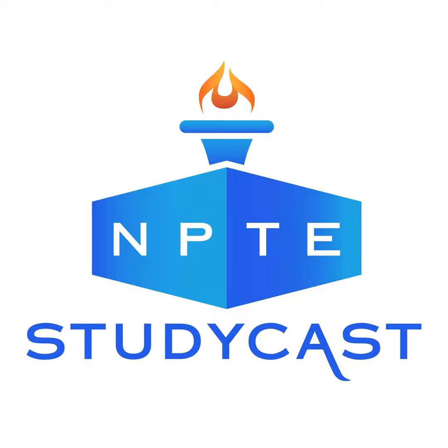Again, if you're on YouTube, you see the visual, this is easy. If you're on the podcast, I'm going to do my best to verbalize this to you. First thing, on every ECG, if you're in an ICU and you hit the print button on the tele monitor, it's going to print you a strip. On that strip, you're going to see the rhythm and the graph paper behind it, but you should also see little tick marks at the top of the paper.